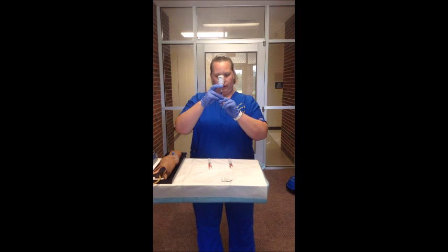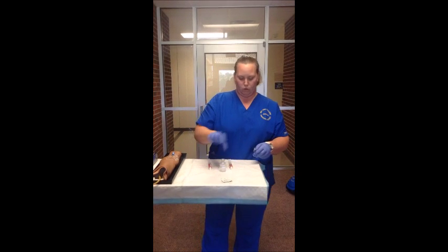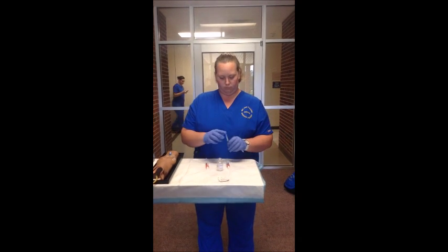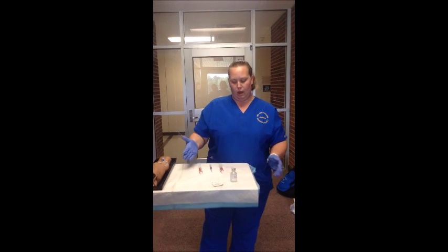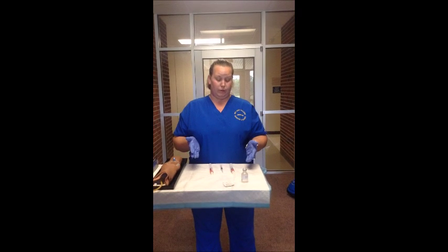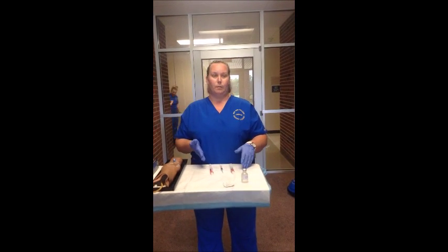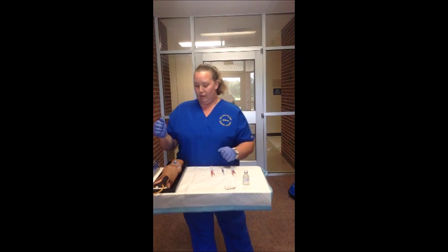Okay, when I've gotten all the air out, now I'm going to do the scoop method. And now it's ready to take to the patient's room. I will be administering 0.125 milliliters every 15 seconds for about a 1 to 2 minute period. And now I'm in the patient's room.